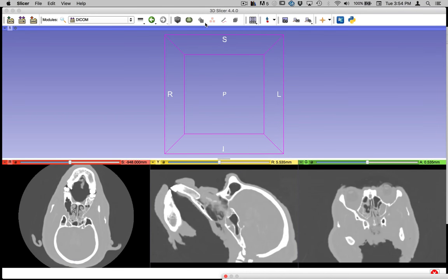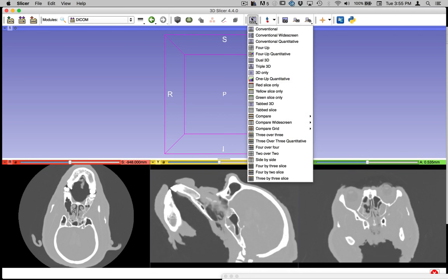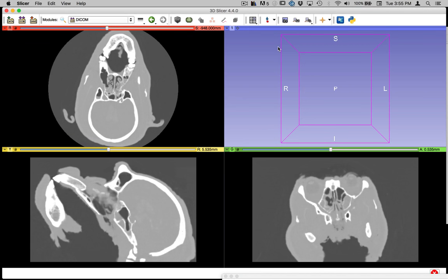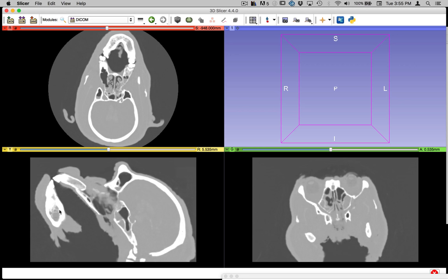And so you may have a slightly different interface than mine. I think the default interface will be the 4-up interface. And so what you're seeing here is the red slice, yellow slice, and green slice. And these are through different directions of sections. So here you can see the shape of the chimp's skull. Here's the brow and the incisor teeth. And so this is in the sagittal section. The yellow is the sagittal section.